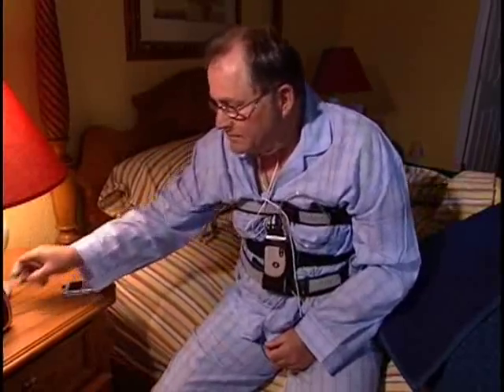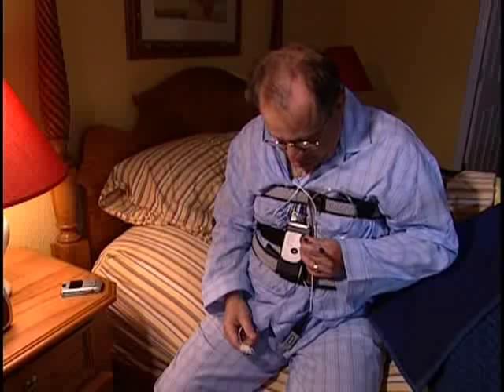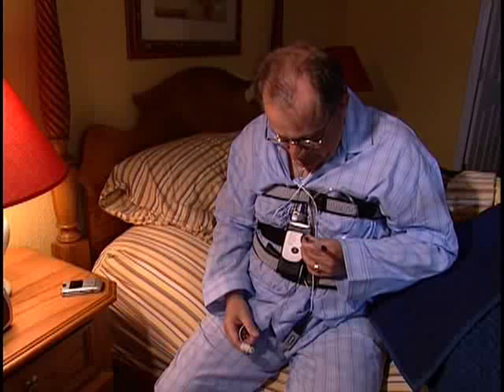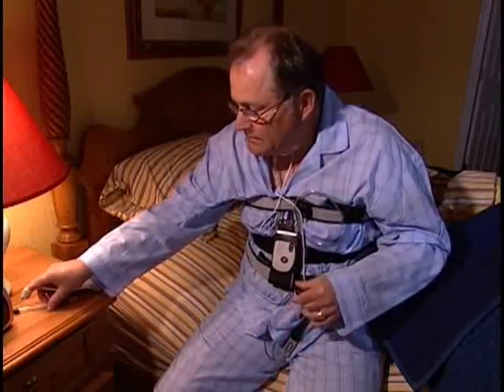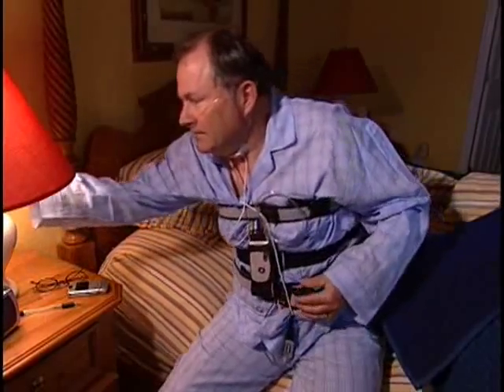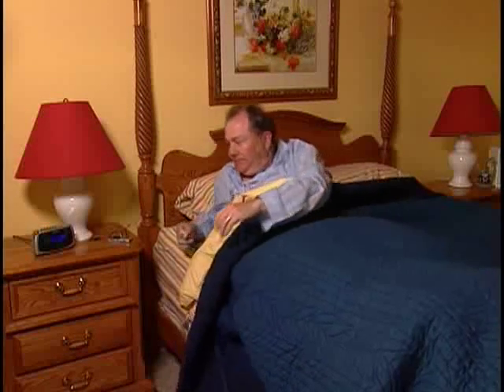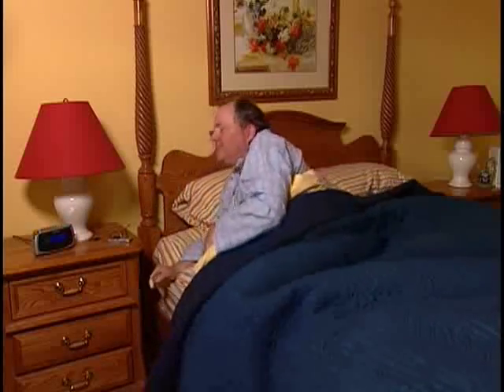Start the recording. If you have been instructed to start the Embletta sleep study, press and hold the Start button until the green light turns on. You may use a blunt object, such as the tip of a writing pen if needed. If you have been advised to stop the recording upon waking, press and hold the Start button until the green light turns off. Upon waking, please disconnect the Embletta recorder and return it to your Embletta provider.